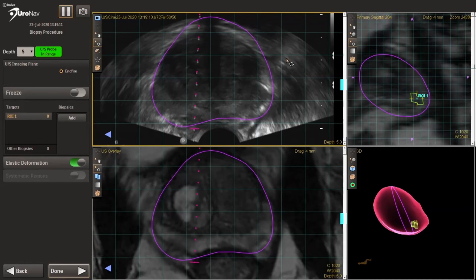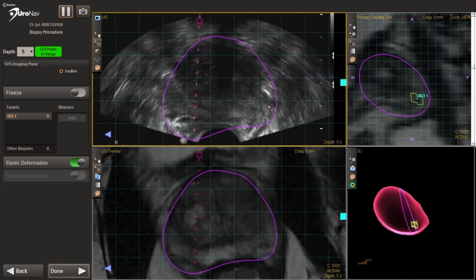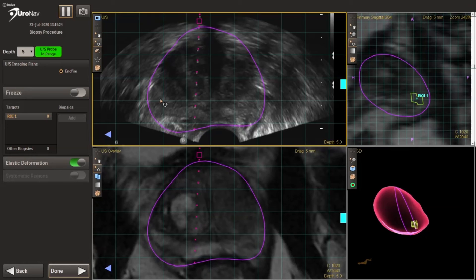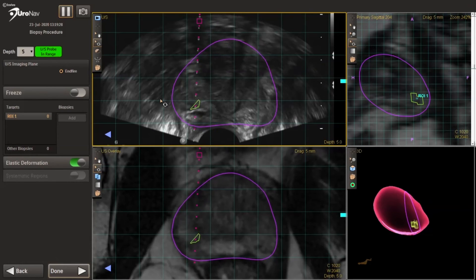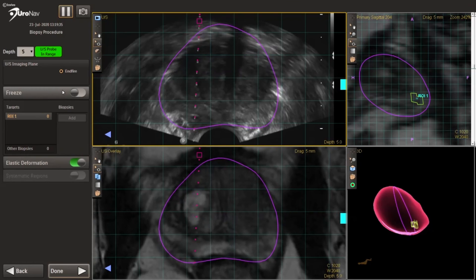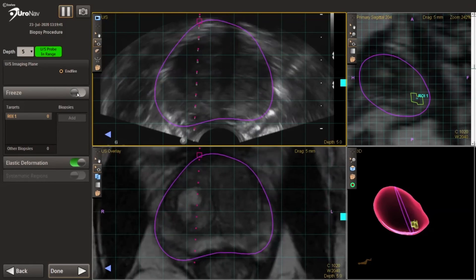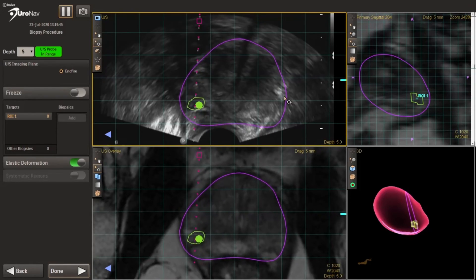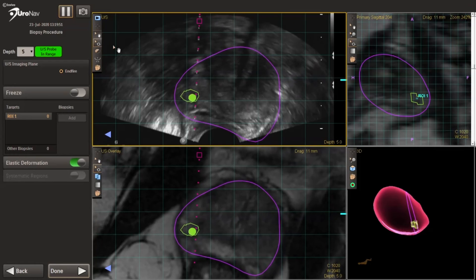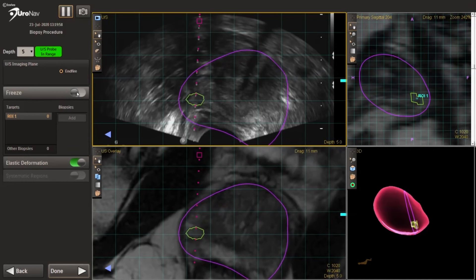Here we're getting our first targeted biopsy lined up. We typically do the biopsies in the transverse plane, and my assistant can rotate the image. The goal is to make sure that the purple outline of the prostate lines up with the ultrasound imaging we're seeing in real time, so we can move or rotate it as needed. We then line up the needle guide with the center of the lesion, checking both the top left to confirm the needle guide aligns with the target, and the pink display on the bottom right to assess the rotational aspect of the probe.